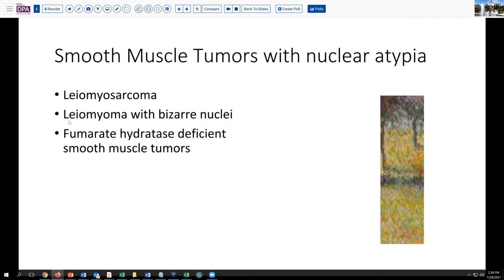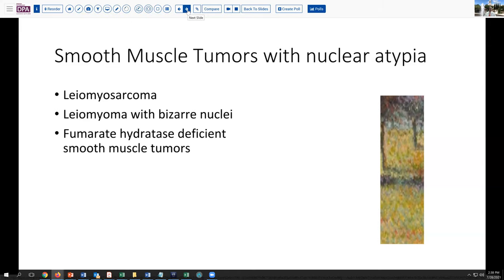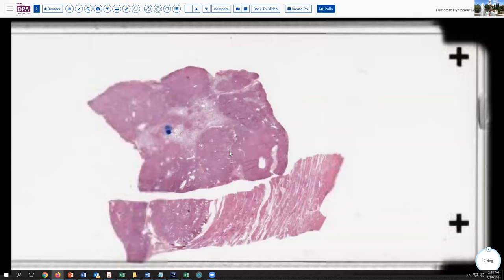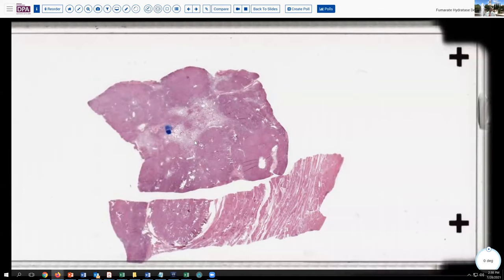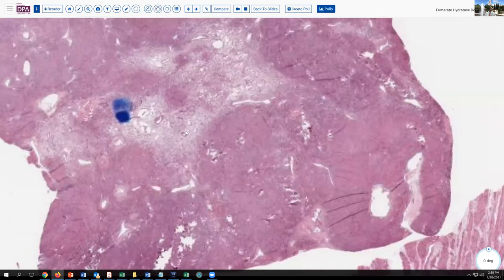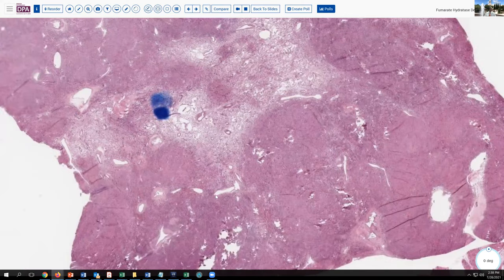There also is the entity known as leiomyoma with bizarre nuclei, previously known as symplastic leiomyoma. And more recently, we've begun to recognize the fumarate hydratase deficient smooth muscle tumors as also being possible considerations in this group of tumors with nuclear atypia. So we'll look at some more slides from here and see if we can recapitulate these findings.